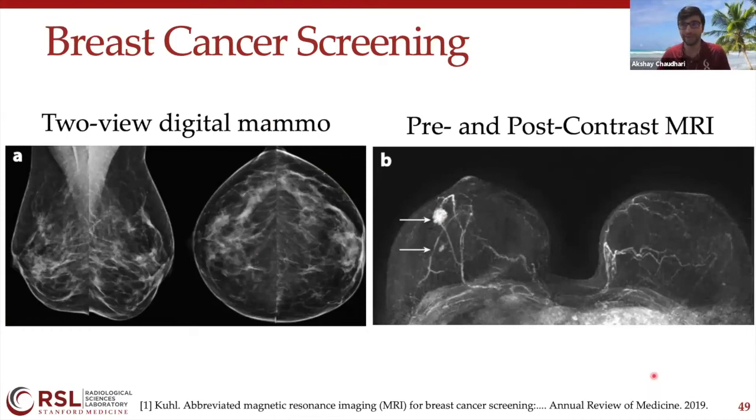widespread screening. And while this is promising, one of the downsides of this fast MRI is still the notion that it requires contrast. Gadolinium contrast is a contraindication if you have lower renal function. It's expensive and it requires an expert to actually inject the contrast. And the use of contrast, even though promising, can really still limit how much screening can actually be performed in terms of throughput for patients.